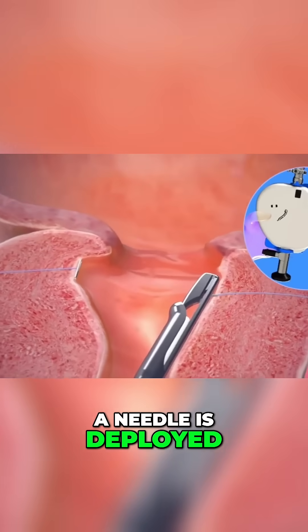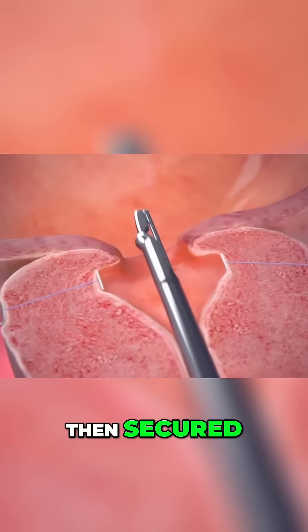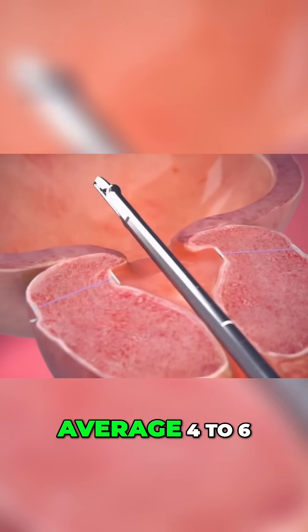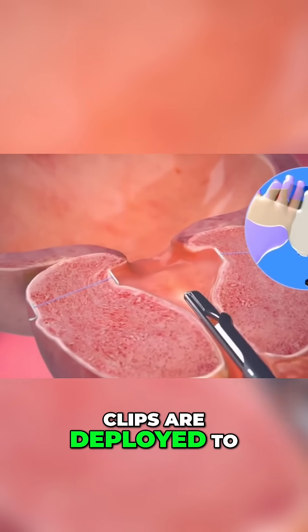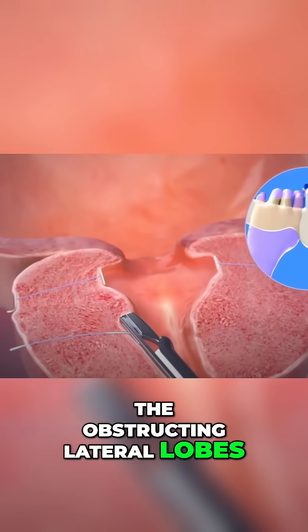A needle is deployed, a capsular anchor is then secured, and the lateral tissue is retracted. In my practice, on average four to six clips are deployed to allow satisfactory retraction of the obstructing lateral lobes of the prostate.